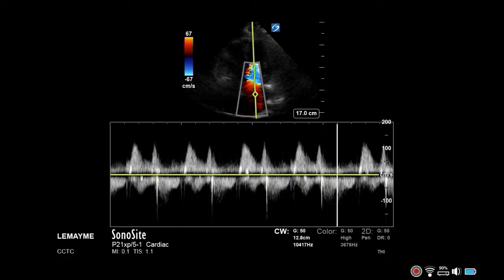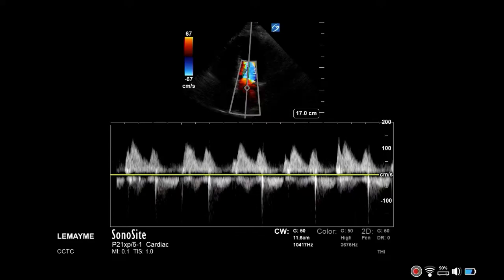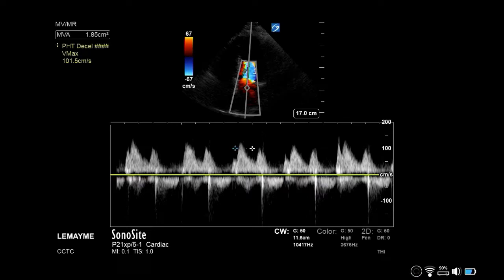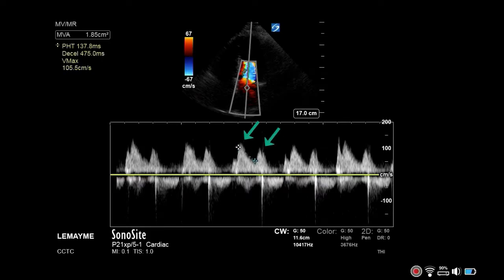The idea for both of these measurements is to measure the slope. As you can see here, some waveforms you obtain will have one or two peaks that are not in line with the slope, and therefore including them would alter the trace of the true slope, so you will need to omit them.